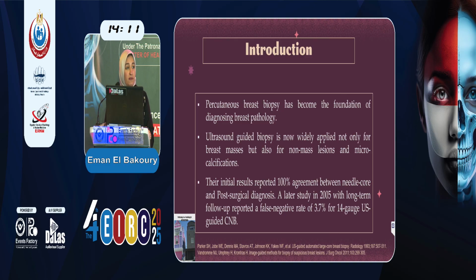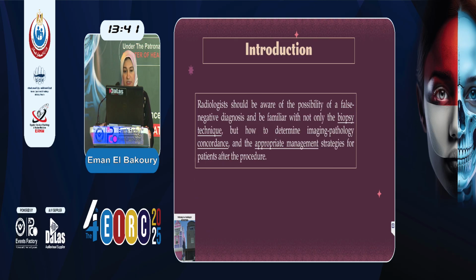Ultrasound-guided biopsy previously was for evaluation of breast masses. However, currently, because of high-quality ultrasound technique, breast ultrasound-guided biopsy can be done for evaluation not only of breast masses, but non-mass distortion and calcification can be evaluated as well. So the initial accuracy upon evaluation by ultrasound was about 100%. However, because nothing is 100%, it drops down to 96%.